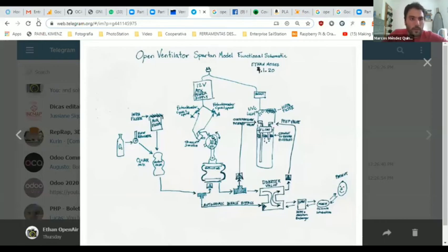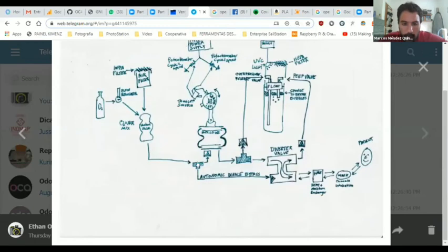Okay, so just to let you know. As you can see here in the bellows system in the center, we have a hose tube, a piping tube. From this hose tubing, we have the oxygen tank, and we have the Venturi valve that the Italian guy sent to us. This part goes inside the bellow, and only if this check valve is closed, because this check valve here is on the diverter valve, the safety valve.